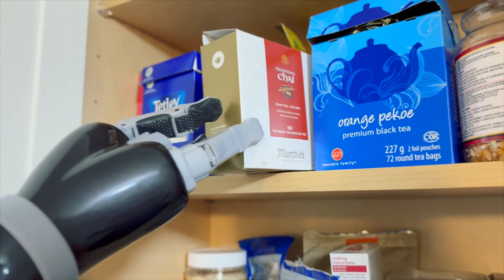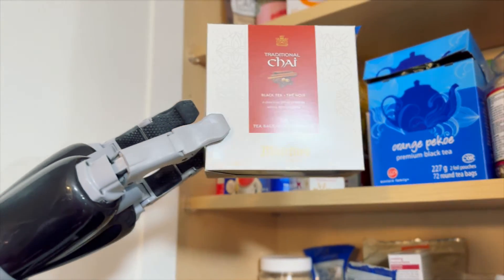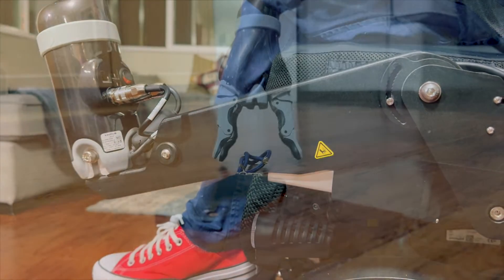Using the lift arm, I've just added a significant vertical reach to Jayco. I can now reach this box of tea with ease. The lift arm can also enable us to reach lower, which is especially important if we've dropped something critical, such as a cell phone.